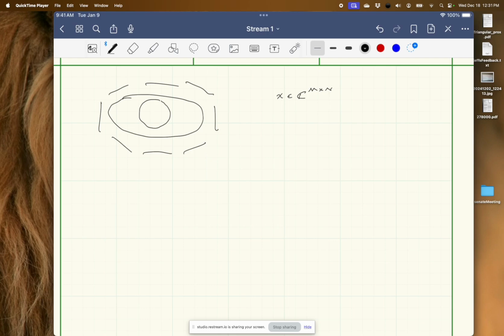Each coil will have a sensitivity map associated with it. So for example, the first coil is going to have S1 as its sensitivity map. It too is a complex array of the same size, m by n, we're discretizing here. In reality, the coil senses on a continuum across space. But here we're going to just discretize it and assume it's a 2D array. The same is true for all coils. And we'll say there are capital C coils. Each of them is a complex array of size m by n.